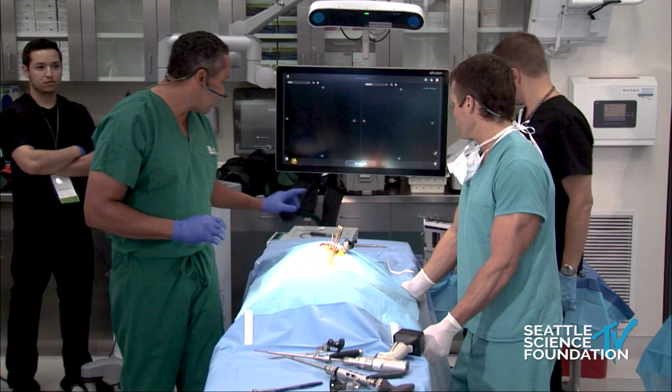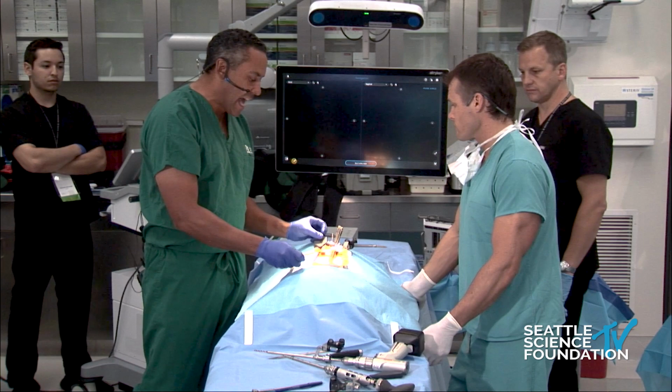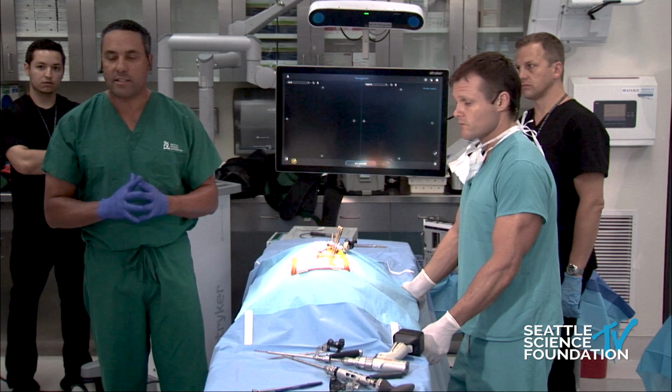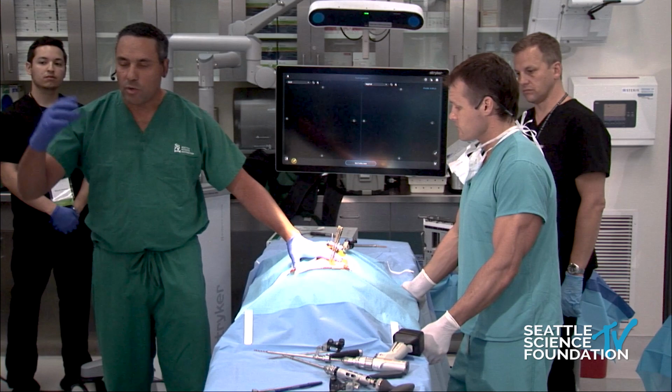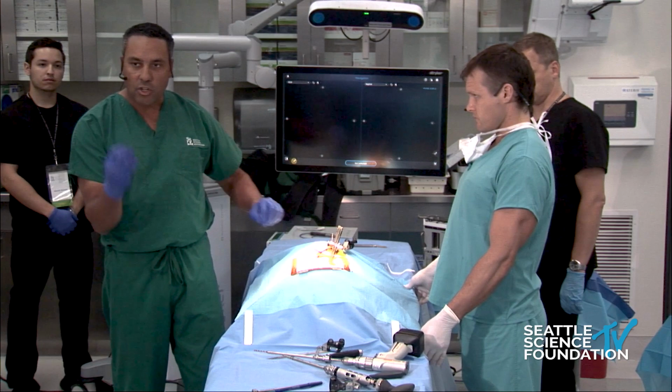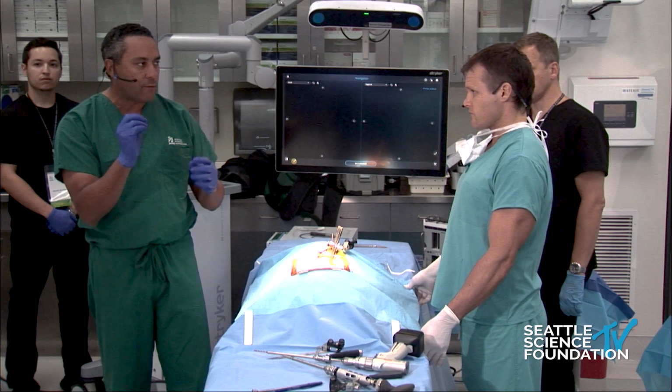The spine mask is actually incredibly accurate, but in my experience, really for three segments. And then the fourth segment is sometimes okay and sometimes iffy. The other issue with the spine mask is that most of this navigation is done with triangulation, right? And so depending on how thick the patient is, you get further and further in the depths. So your entry point for the screw can be quite good, but the exact trajectory gets off a little bit when you get into the depths.